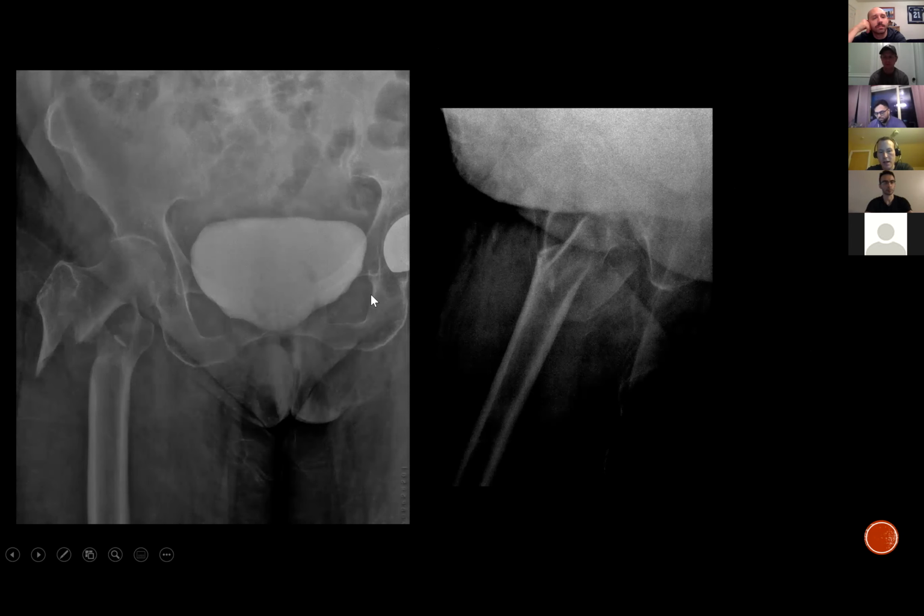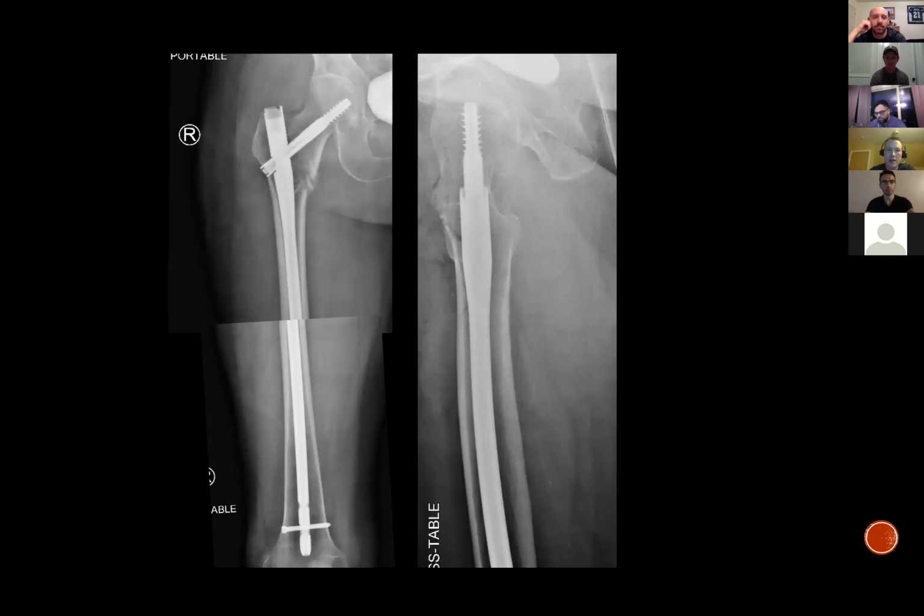Both a sliding hip screw and a cephalomedullary nail are designed to allow shortening to occur along the bolt, okay? Whether it is this kind of bolt that's going through a nail, or if you had a sliding hip screw with a plate here and a barrel and a screw coming out of it, it's designed to be able to shorten across that, okay?